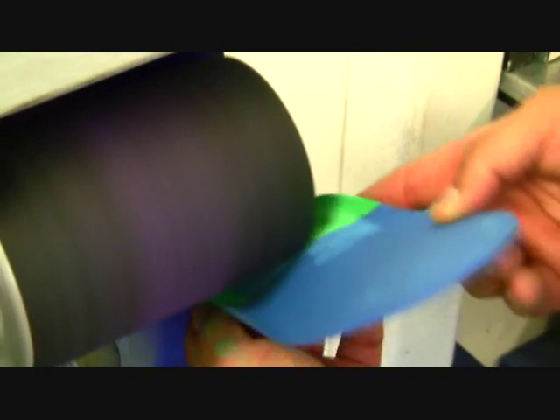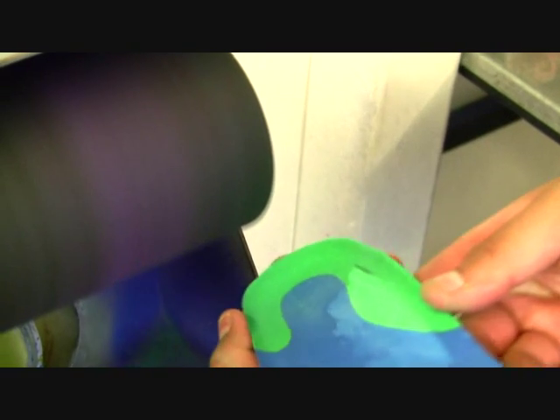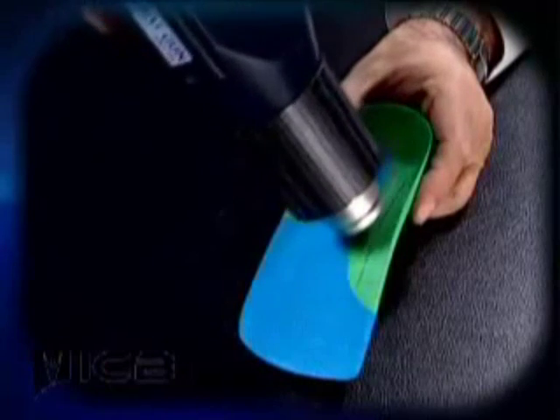If you have done this correctly, you will see a distinctive drop off on the orthotic which gives relief to the fascia. A simple option is to use a heat molding orthotic, in which you can use a stiff metal object to create the fascial groove.